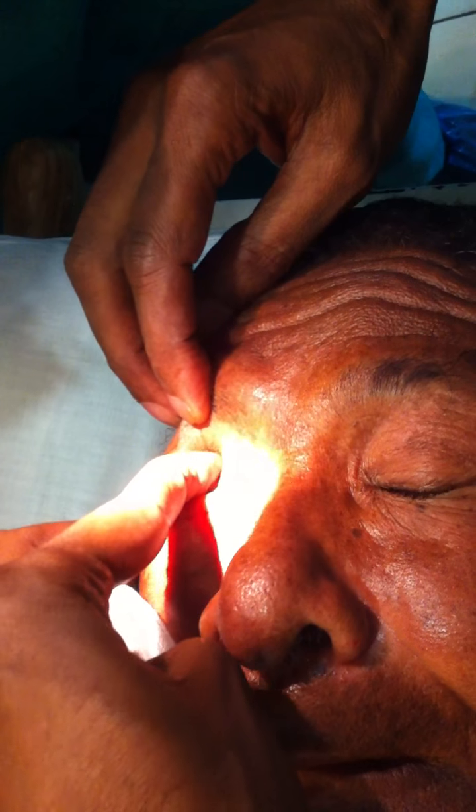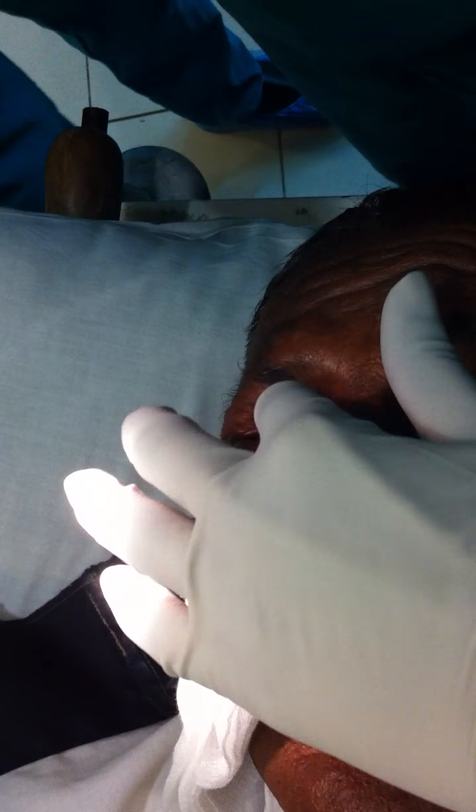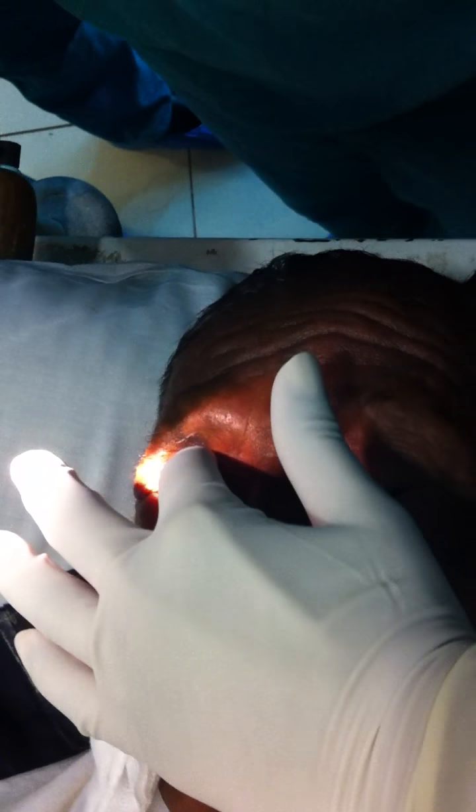Usually it's better to go without gloves. Now this is my nail — go like this. Remove your finger from the globe.